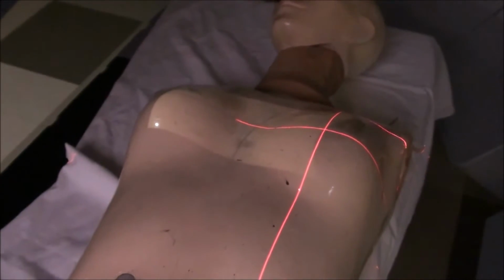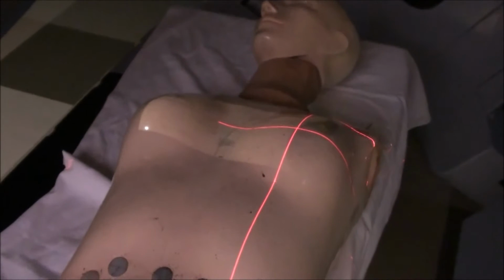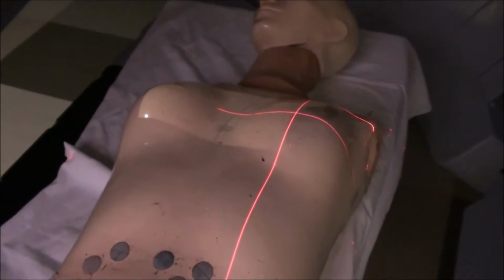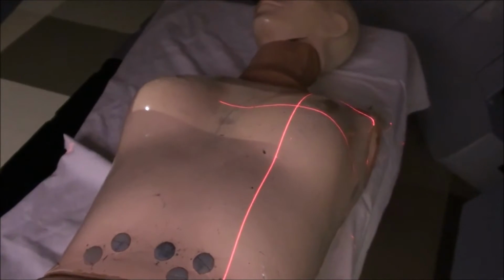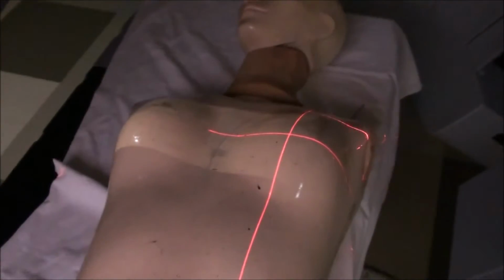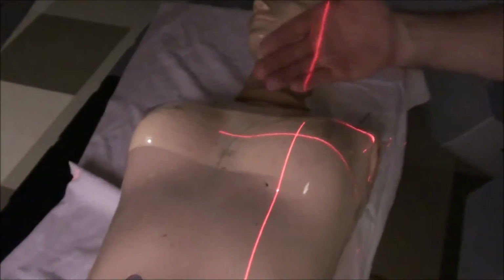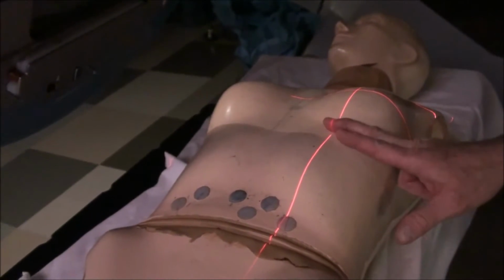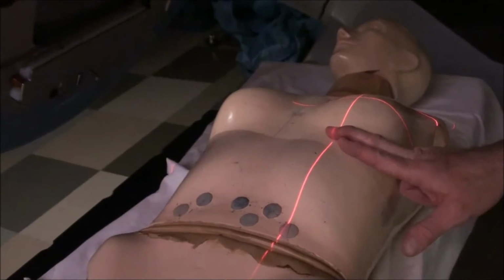You also want to then open your field size such that you have flash about 1 to 2 centimeters across this way, and you can see the flash on the image intensifier. And then you're going to have the field length such that you have 1 to 2 centimeters inferior to the inframammary fold.